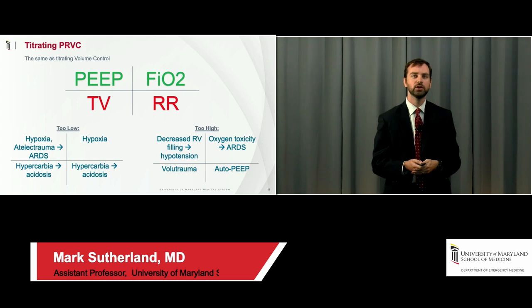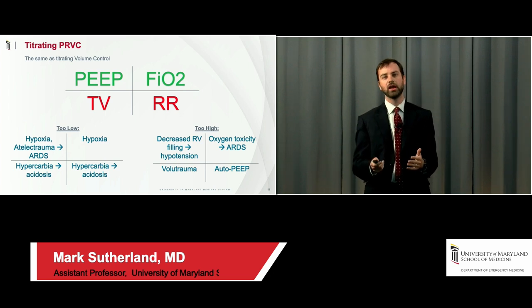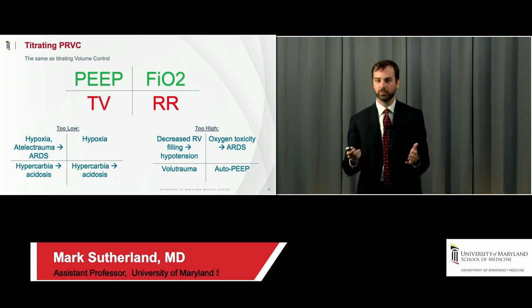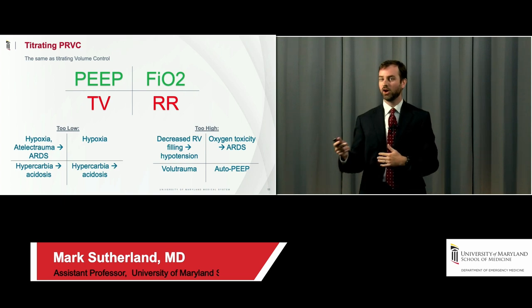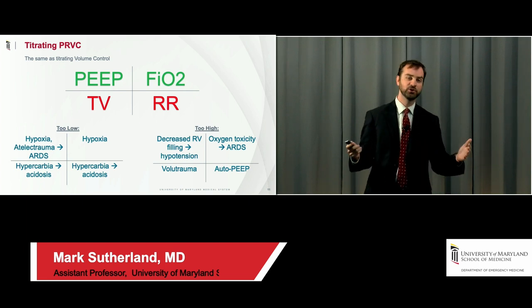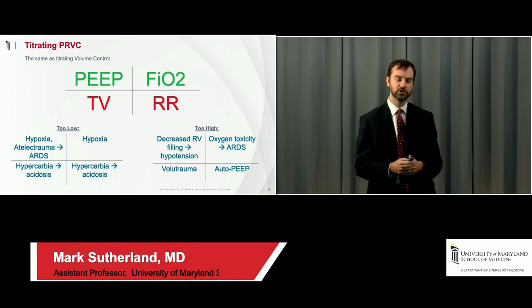Okay? So titrating PRVC. For each of the three modes we're going to talk about, I have a slide walking you through how to come up with settings and how to titrate those settings. I think this is the most important for the ED doc to know. Your respiratory therapist, the person you get signed up from, whoever, may have put the patient on PRVC, on APRV, on SIMV, whatever the case may be. And if you run into a problem with the patient, you need to know what to change. Obviously, one option is just change the mode, of course. But you need to know what to manipulate to improve the patient's clinical situation.